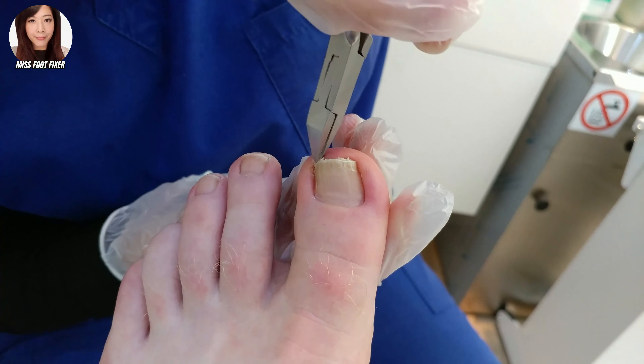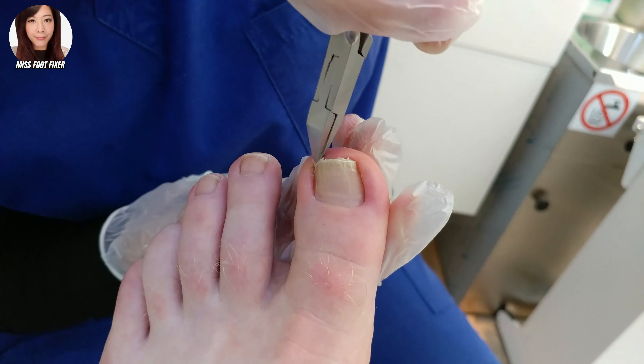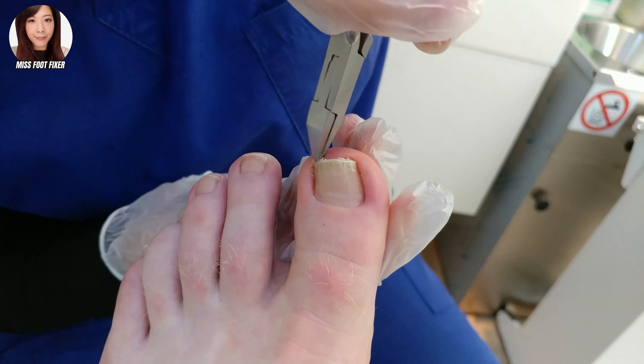When we treat a fungal nail infection and ingrown toenail, it needs a lot of persistency and consistency, and he's done a lot of it himself. Let me just follow these nails down. This one's okay too — cut this straight, a little bit thick.